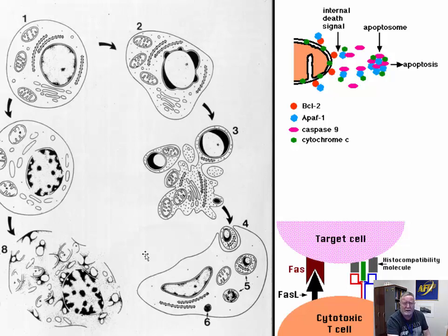And then it breaks up into little pieces, and the little pieces are generally phagocytized by macrophages or other phagocytic cells, where they are broken down, and then you will end up with a secondary lysosome with some lipofuscin in it from breakdown of the membranes of the various organelles.